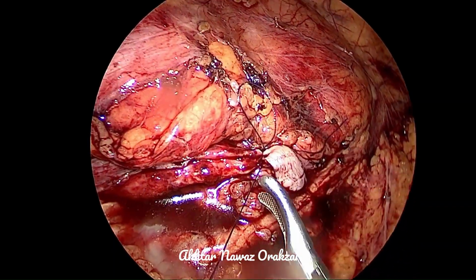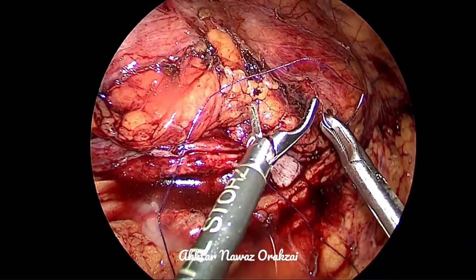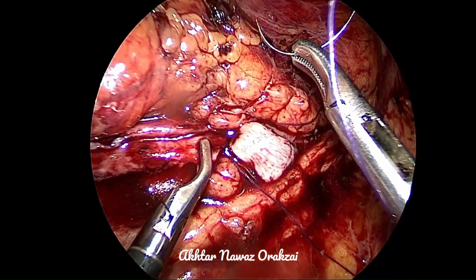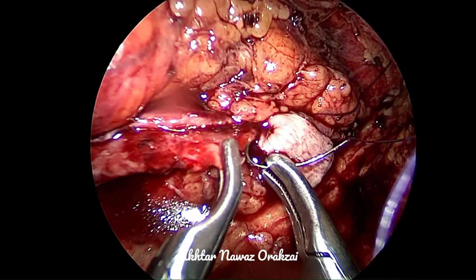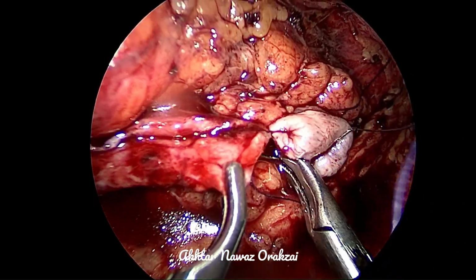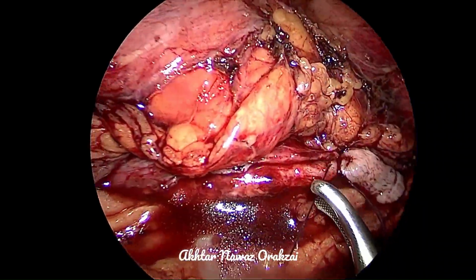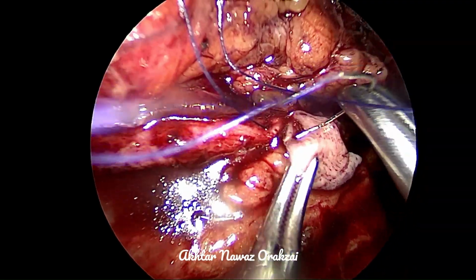In that way it will be easy. Some people do the repair of the posterior lip first and they find it easier. However, in this case I think doing the anterior lip and doing the repair from the inside will make it easy for us.